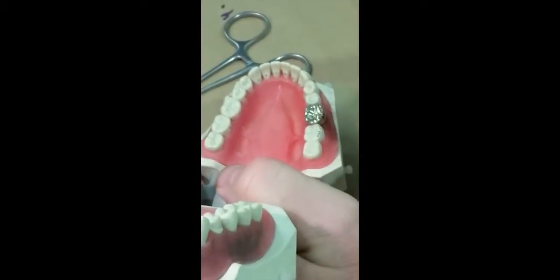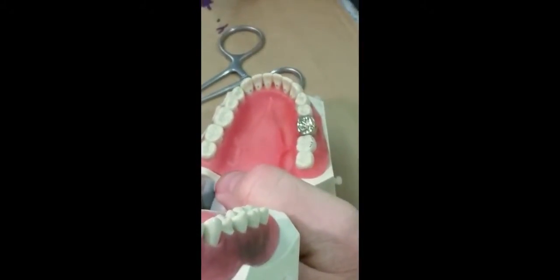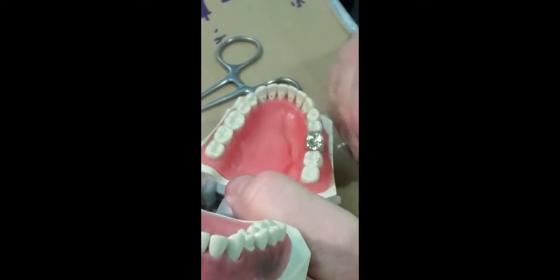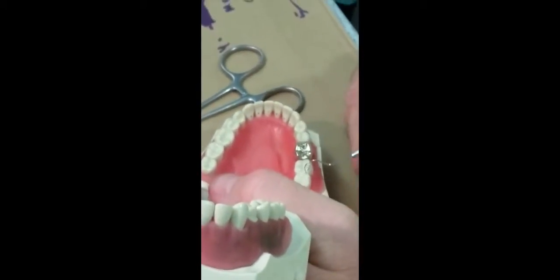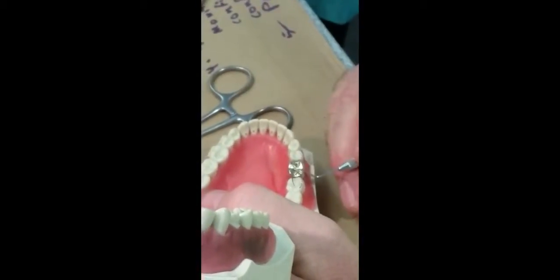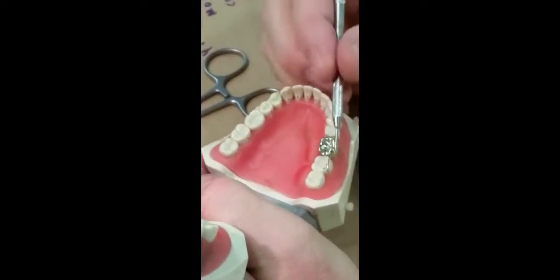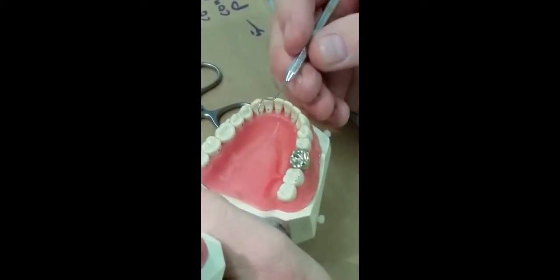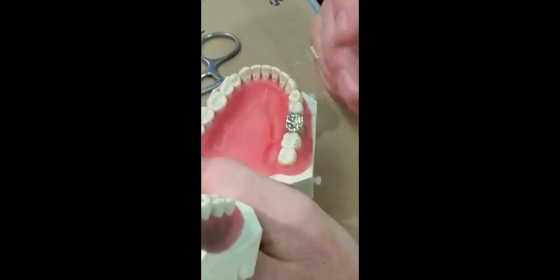One issue with the location of contacts: if all contacts are on an incline in one direction, we'll tend to push the tooth that direction. It means it will adjust itself quickly and won't be high by the next day, but it also means we can shift the tooth forward and create an open contact. This is particularly a problem when cementing the most distal tooth in the arch. Never just put it in and assume it's okay because the mylar holds — look at the position of the contacts. If the only contact is on the mesial incline, when the patient returns next week they'll have an open contact.